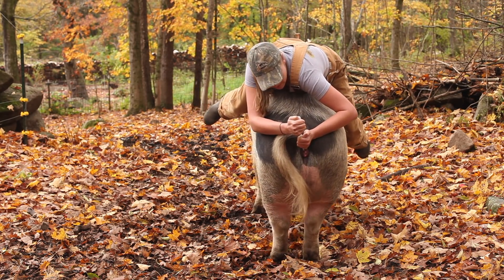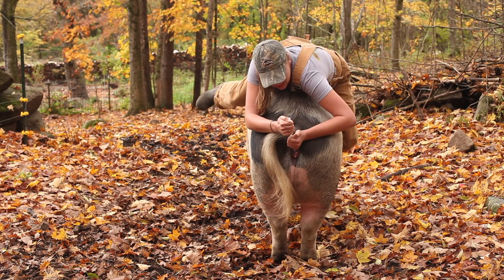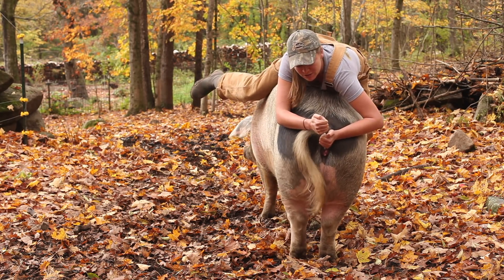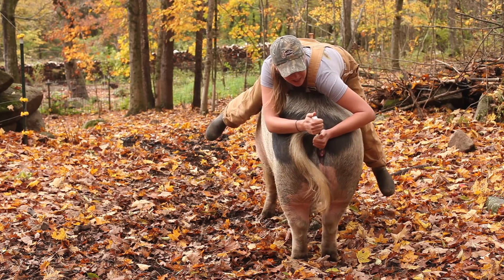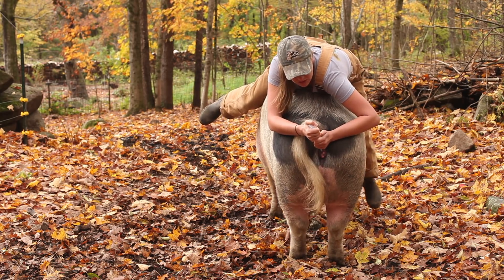Now you want to make sure that you are breeding every 12 hours at third standing heat. I gave her her first dose yesterday right after lunch, and then I came out at midnight and bred her last night with my husband, which went really well. And this is her last dose.